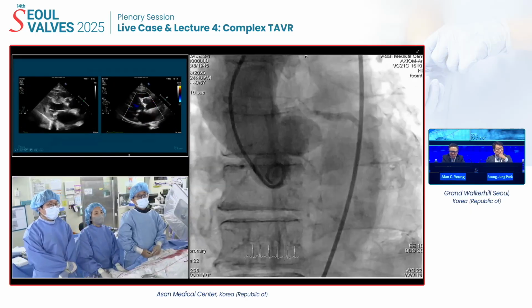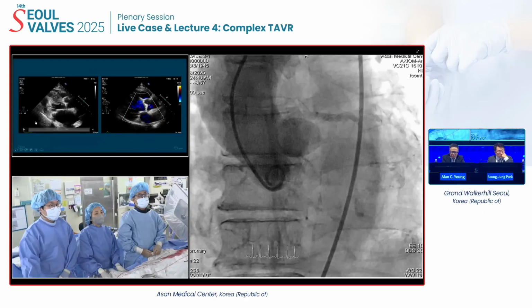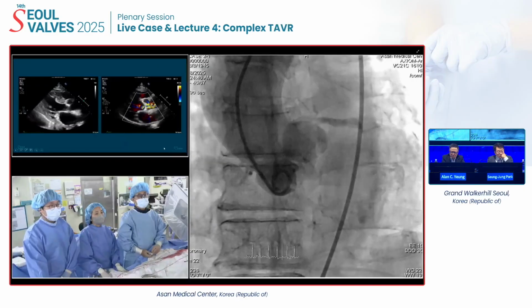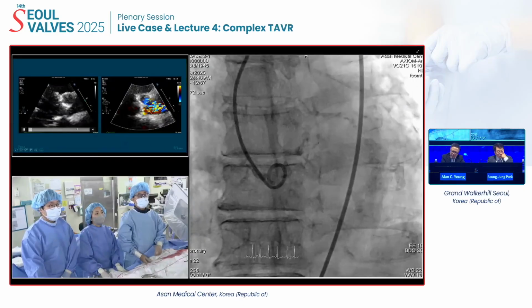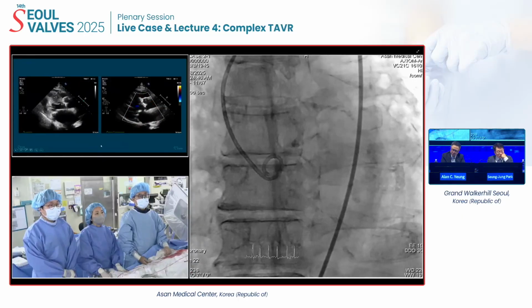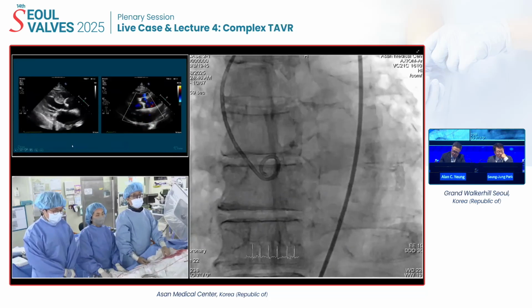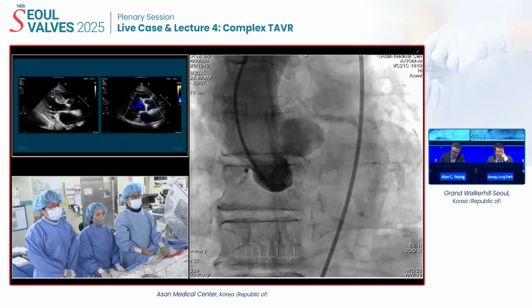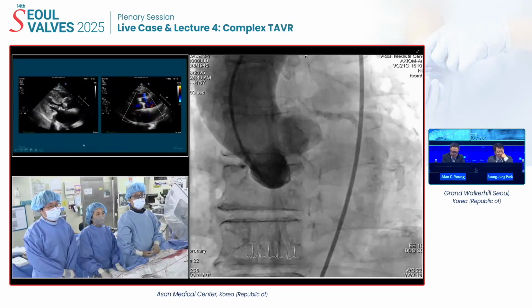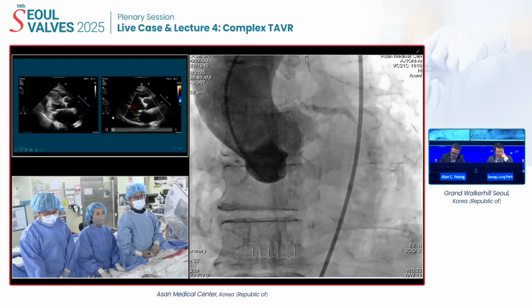The echocardiography shows very severe AS with hypertrophy in the lateral wall and septal wall, approximately 2 centimeters. Initially, NT-proBNP was elevated at 554. By definition, a patient combining severe AS and LVH with elevated BNP has heart failure with preserved ejection fraction.